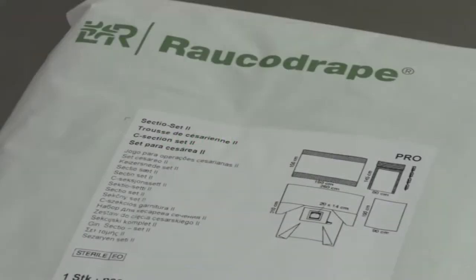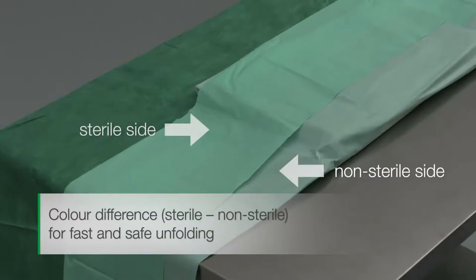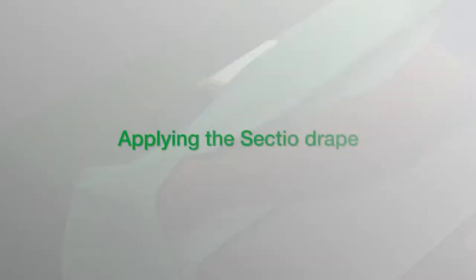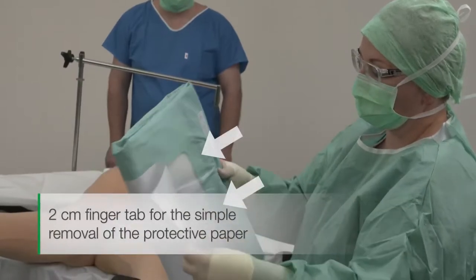Getting started with opening the set. The color difference between the sterile and the non-sterile sides makes safe and quick unfolding easier. First, the protective paper and all-in-one drape are removed. The two centimeter finger tab makes this process very easy.